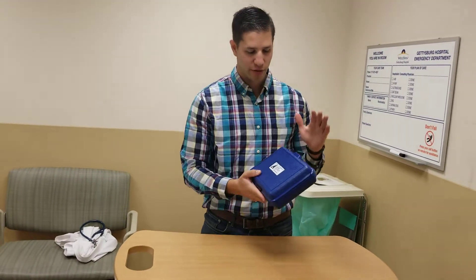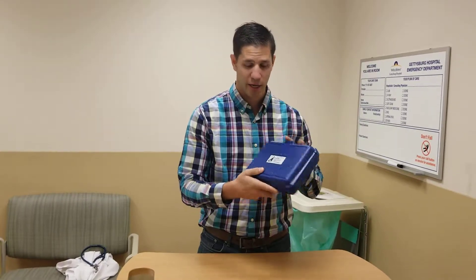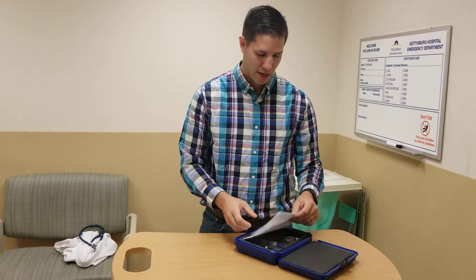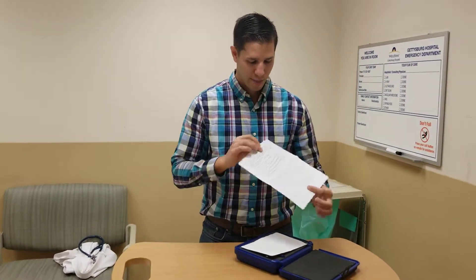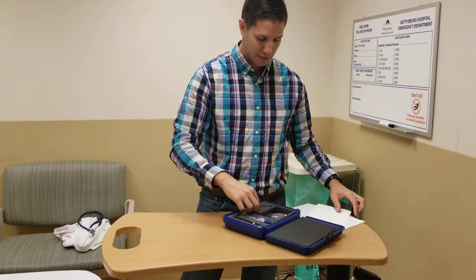Hi guys, we're going to go over how to calibrate and use the AccuPen. This is in the blue case here in the emergency department. So we're gonna go ahead and pop this guy open. There are written instructions about how to go about this inside the case, so we'll just jump right into it.